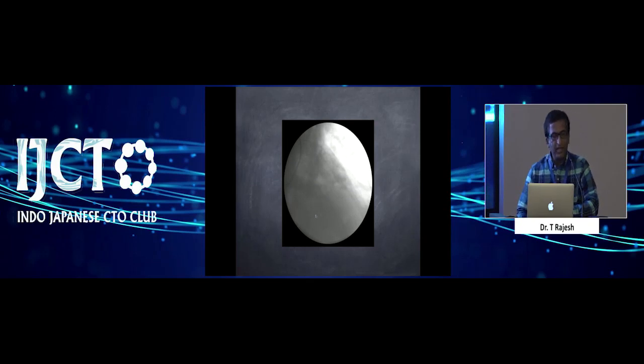We have no idea whether there's calcification beyond the lesion, the length of the occlusion, or the presence of collaterals from the invasive angiogram. So we need other imaging modalities to help us plan a procedure and achieve greater success. That's why multi-slice CT helps you in achieving all this.